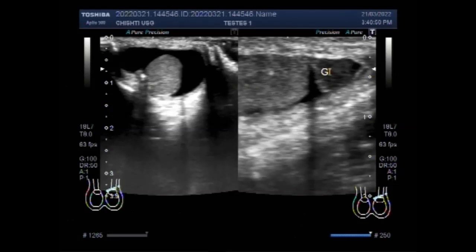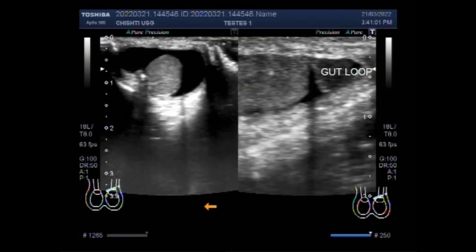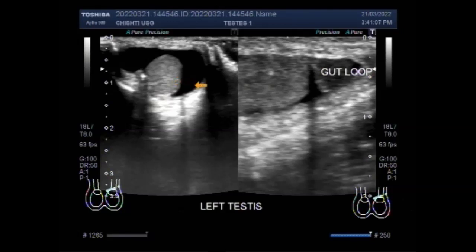Now you can see this is the area of the gut loops which has entered into the testicle area along with the scrotum.